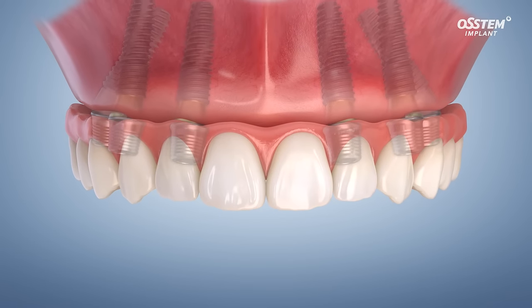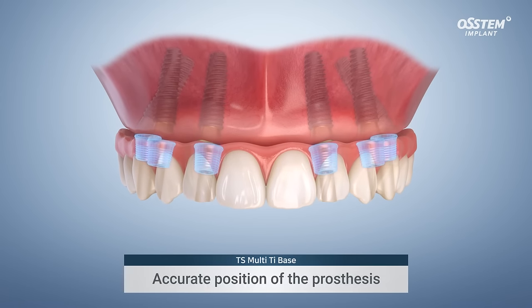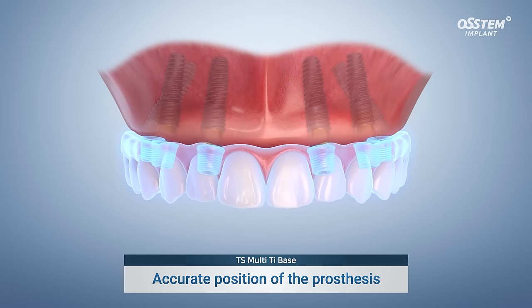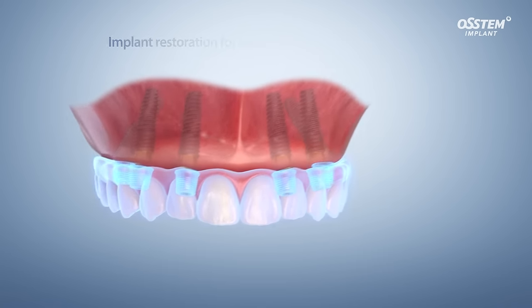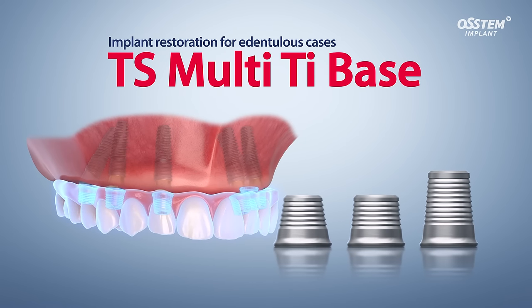To ensure a proper fit and eliminate any possible errors, the prosthesis must be seated in the mouth before being cemented onto the TI base. Try our simple and accurate TS Multi-TI Base.